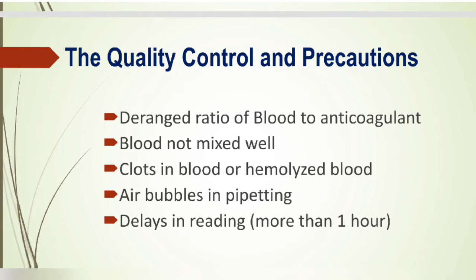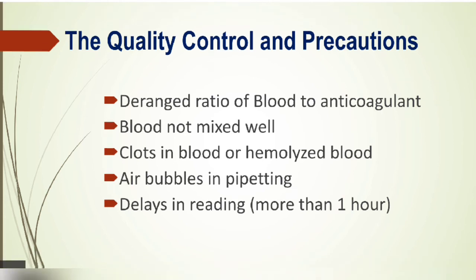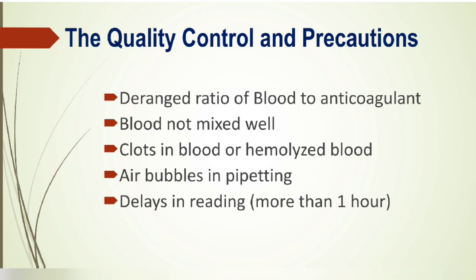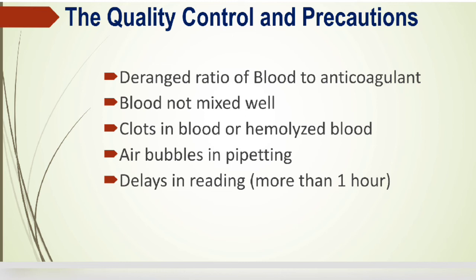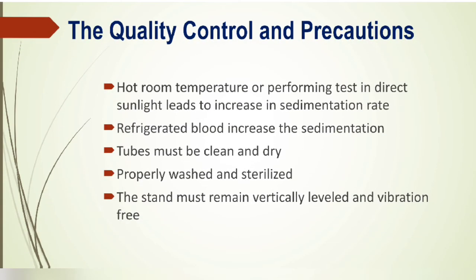Quality control and precautions: the ratio of blood to anticoagulant must be correct — one part anticoagulant to four parts blood. Blood must be mixed well after adding the reagent; clots or hemolyzed blood will cause defects. Air bubbles affect the volume in the pipette. Delays beyond one hour in reading will cause falsely elevated ESR values. Hot room temperature or direct sunlight exposure and use of refrigerated blood can also increase sedimentation rate. Tubes must be clean, dry, and properly sterilized, and the stand must remain vertically leveled and vibration-free — no centrifuge should be placed beside the stand.